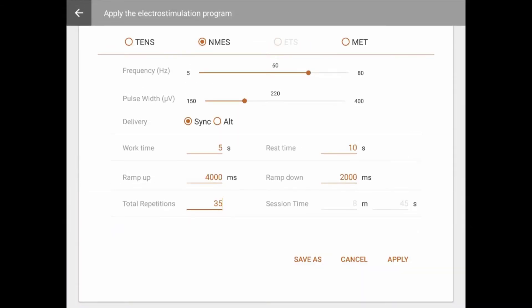NMES programs can be delivered in synchronous, where all channels work and rest simultaneously, or in alternating, where odd channels A and C work while even channels B and D rest, and vice versa. This is useful for antagonist muscle or reciprocal motion.